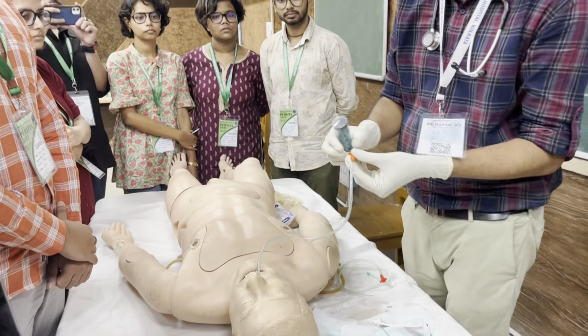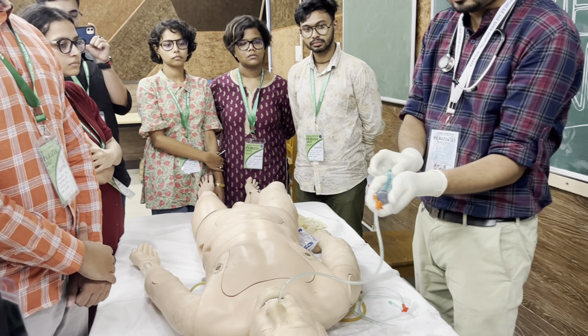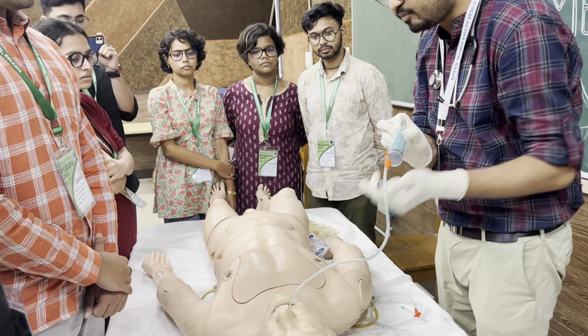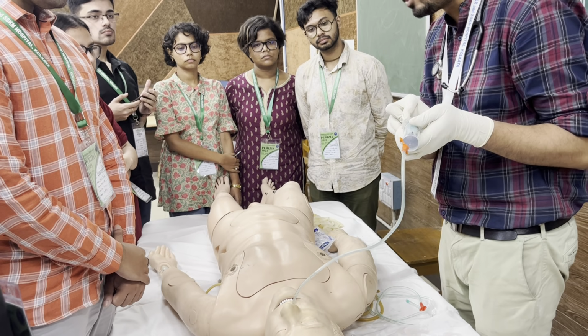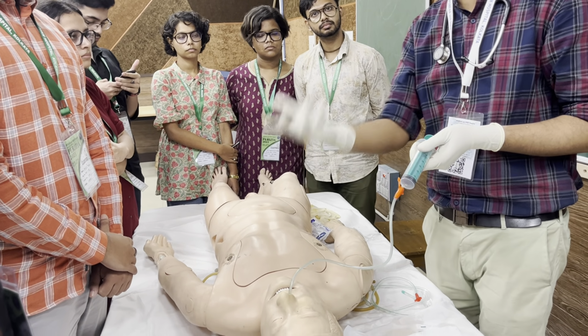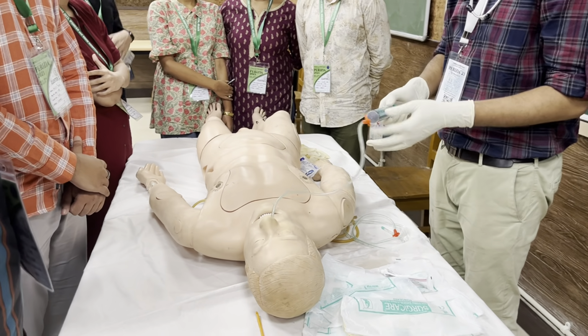You can aspirate the contents, gastric content. So I am aspirating. As I am aspirating, can you see something coming out? Can you see a column of water? As we have already put some water inside the mannequin. See, the water is coming out from where? From the stomach. So ideally, in a practical scenario, gastric food material content or anything will come out. Okay. The second and the third, how to confirm?